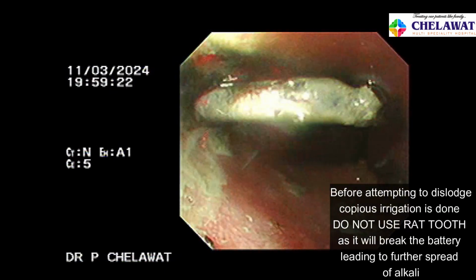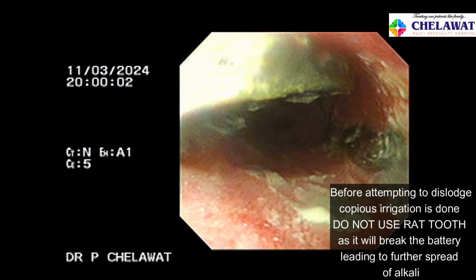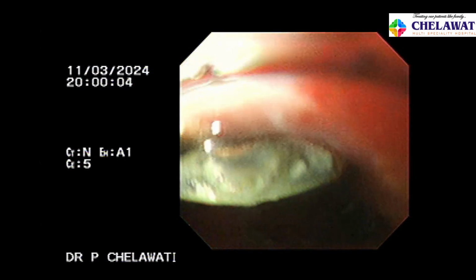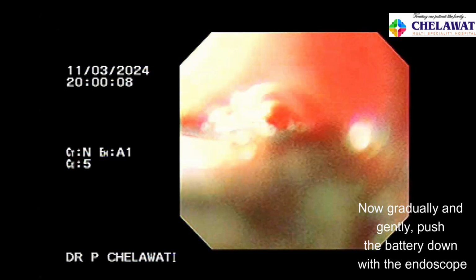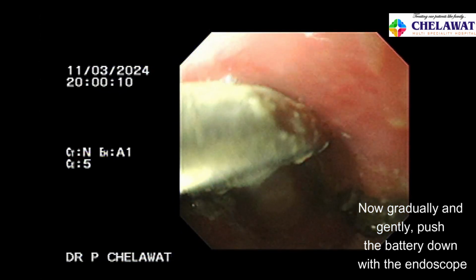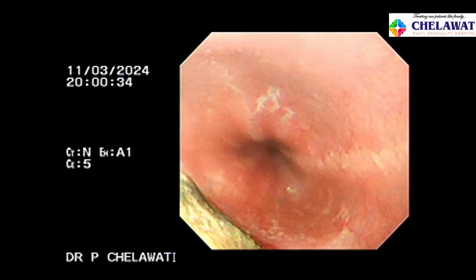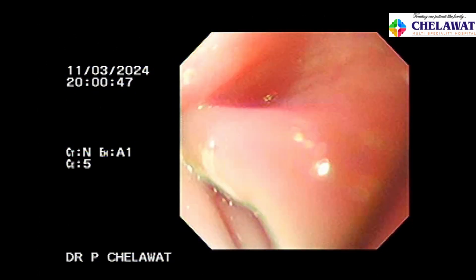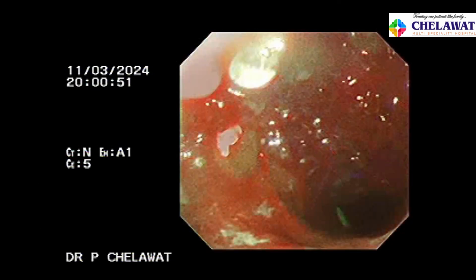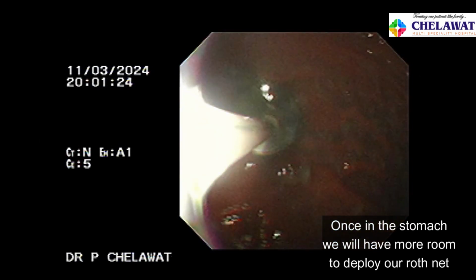What we have to do is pour copious amounts of irrigation of water or normal saline, dislodge the battery very gently, push it into the stomach very gently, and then hold it with the help of a Roth net. Do not attempt to catch hold of the button battery with a rat tooth, because it is going to break the button battery, thereby releasing the alkali further, sticking the button battery to the mucosa.